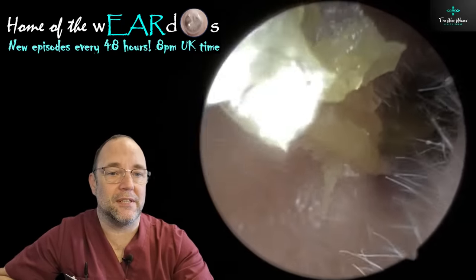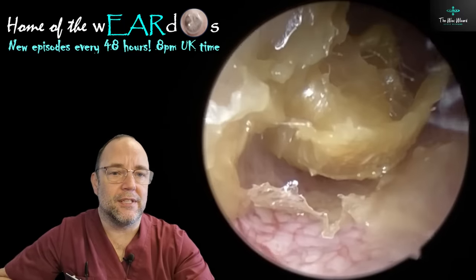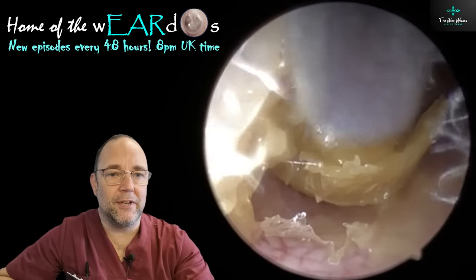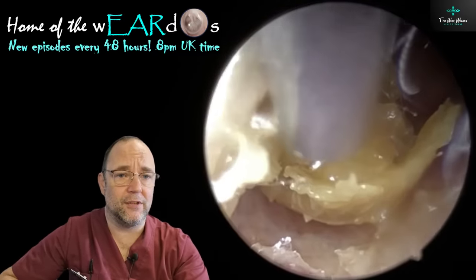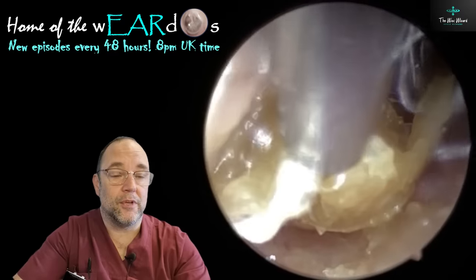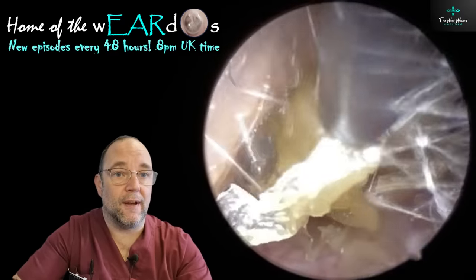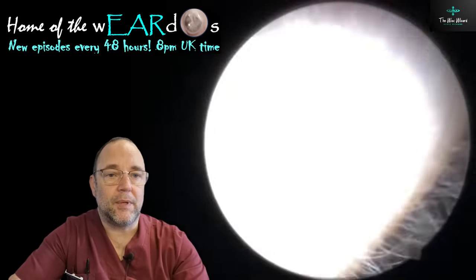What this lady has here is a lot of skin in here - a lot of skin. She has a really difficult ear to get into. It's very, very bendy, very twisty, very narrow. You can't appreciate that from the video here. This is the fine end tube, which I do use for a lot of these more delicate procedures when the ear is so small, because when it's quite narrow to get into, you literally can't fit the endoscope and the tube in there at the same time. It's very difficult. But we're already making reasonable headway.